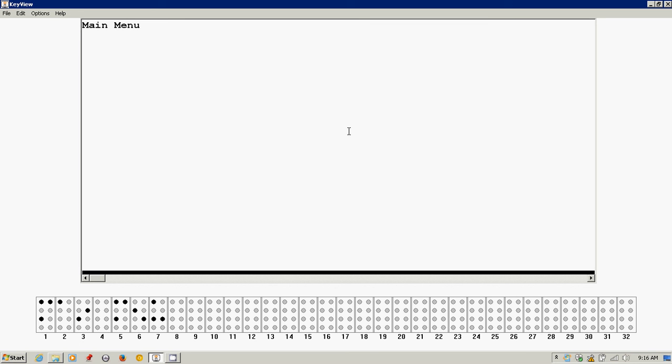From the main menu, what I'm going to do is jump to the utilities menu by pressing the letter U. I could space to it as well, but I'm going to press U.